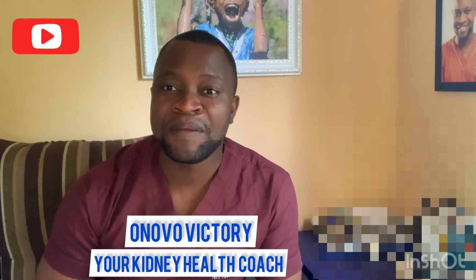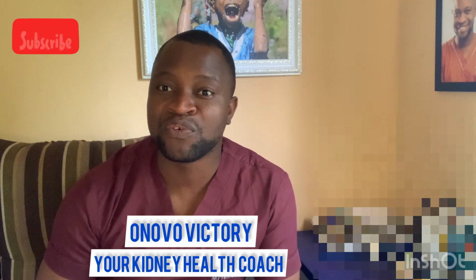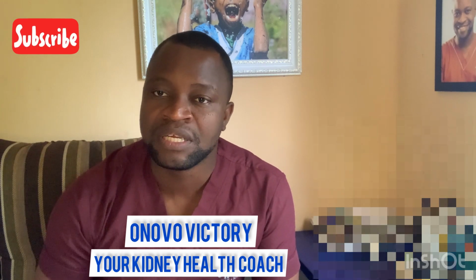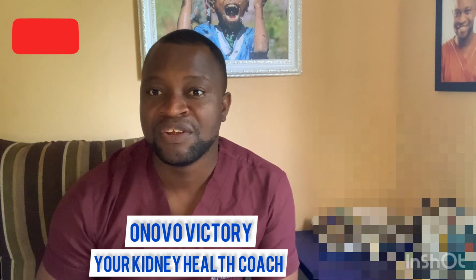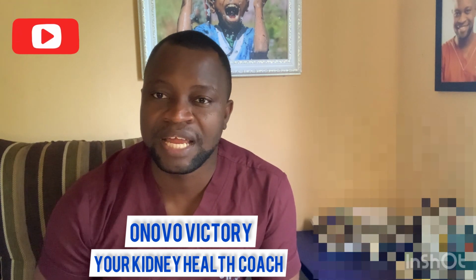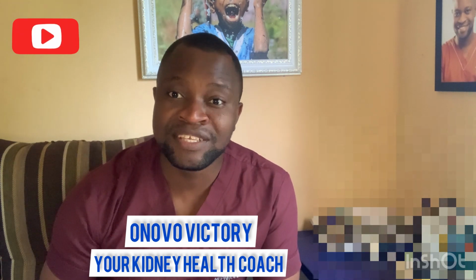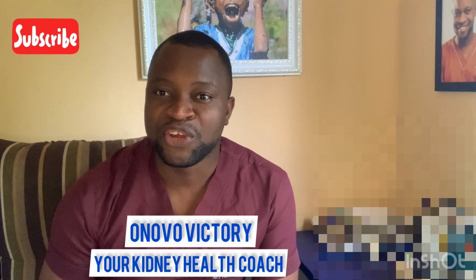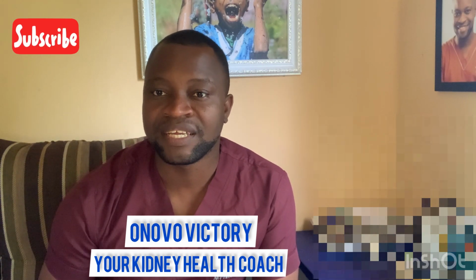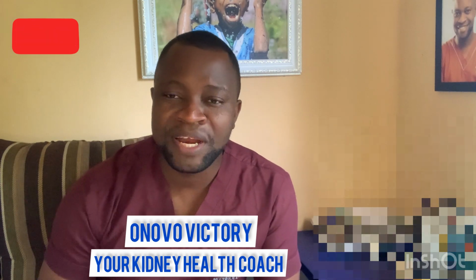Another very important thing you must find out is their range, so that you'll be able to say that yes, something is actually wrong, or you can raise an alarm. They also aid you in taking your drugs. That is why we encourage people to do blood sugar checks at home. So what are you checking for?